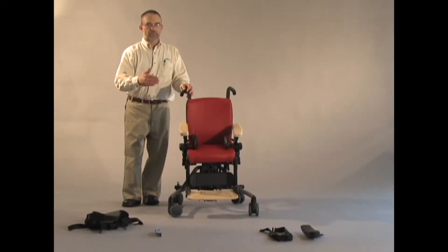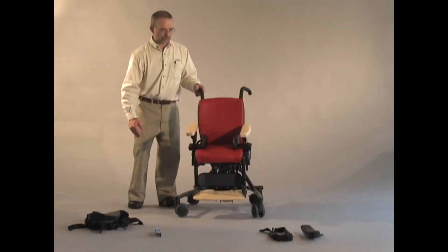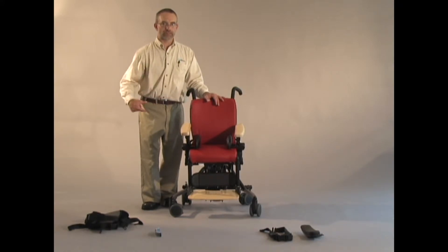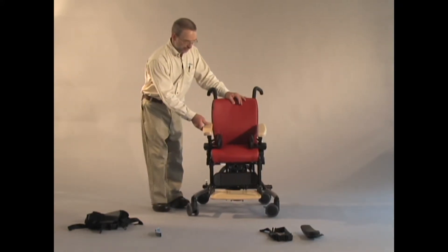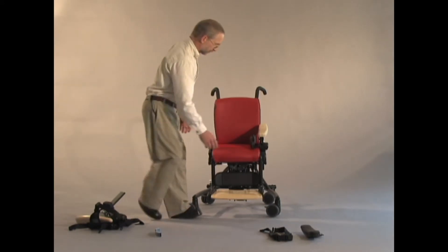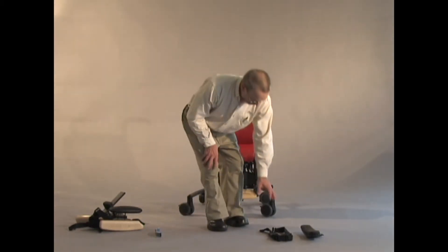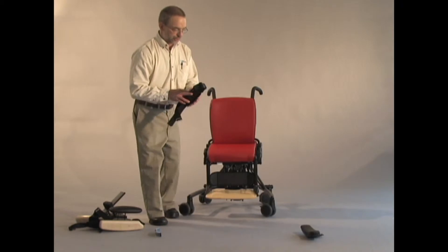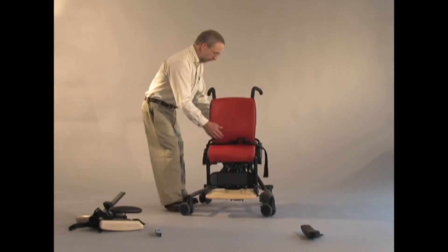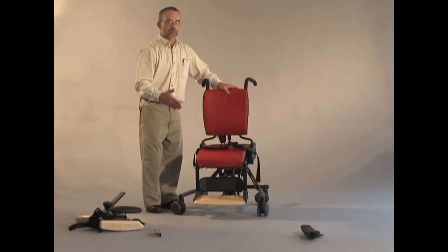Some therapists have asked for more support further forward on the child. For some children, if they have an abdominal tube, it may be inappropriate to have a lap belt crossing directly over the abdomen. And so we have a lap belt, and for that I will remove the armrests. The lap belt is the one belt that installs a bit differently than the other seat belts and butterfly harnesses, because we have a full 5 inches of seat depth adjustment and we needed the lap belt to be able to move with the seat.